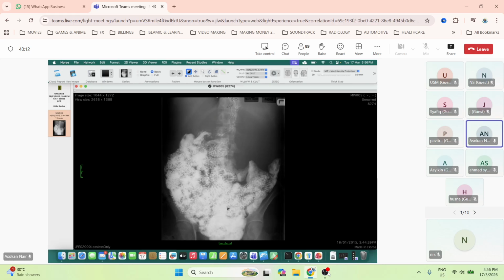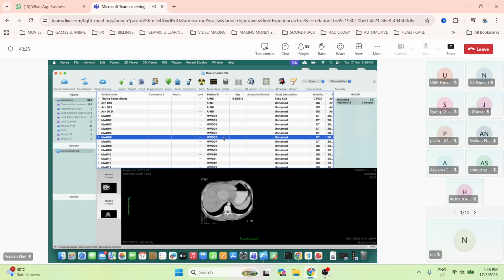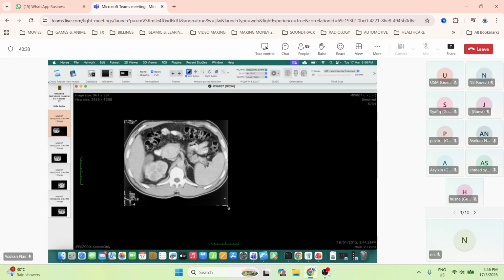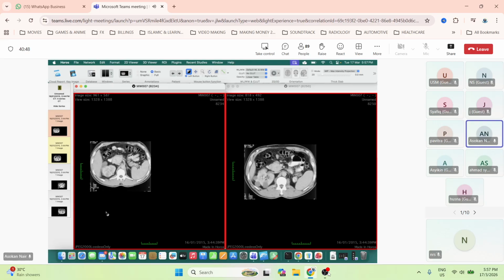Okay, next. I think we'll skip this because I doubt you'll be asked small bowel follow through anymore in your exams. So don't waste time there, right? Okay. See if I can get this. Okay, come next.